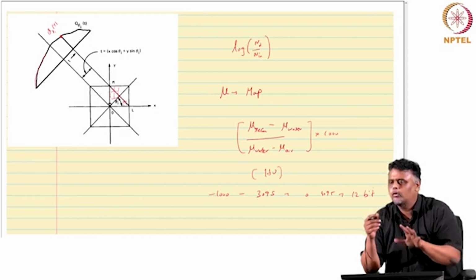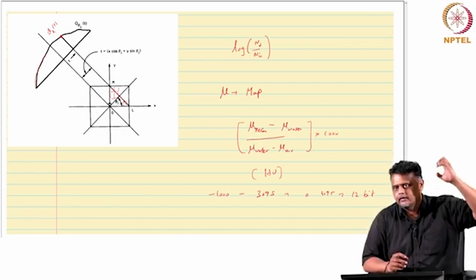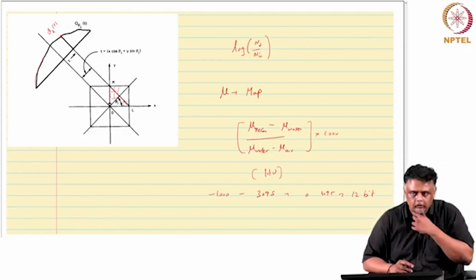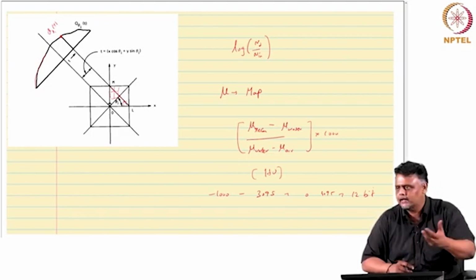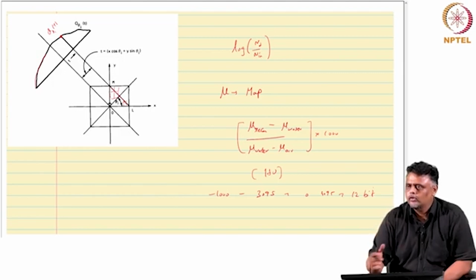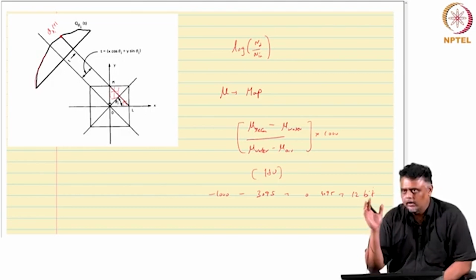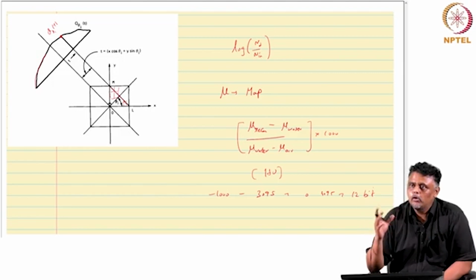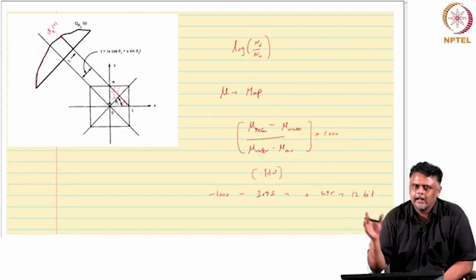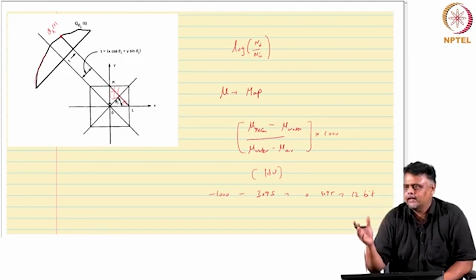It is an indication of mu, an average mu, because your X-ray spectrum is polychromatic. If you had a monochromatic spectrum, you would ideally get the exact value every time. Within the limits of noise, this should be the same for different scanners. Bone typically gets a very high number, more than 2000. So you can reliably say that anything in that region is a very high density or high Z material.